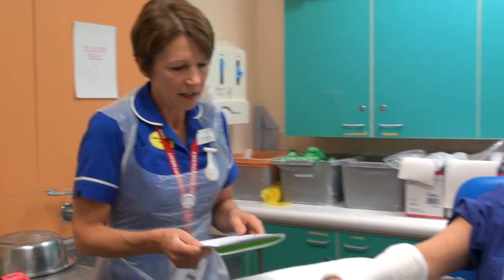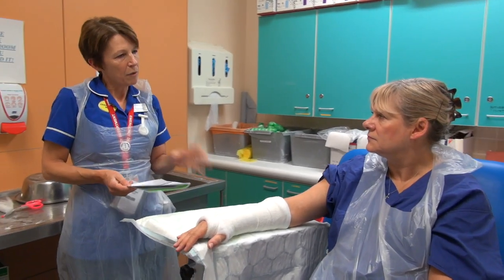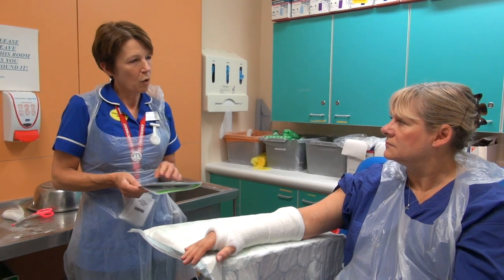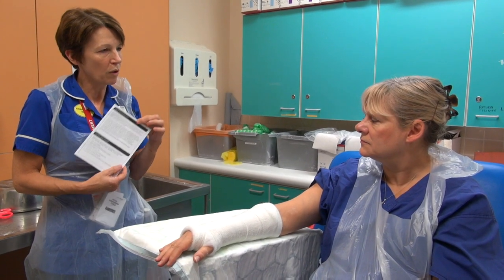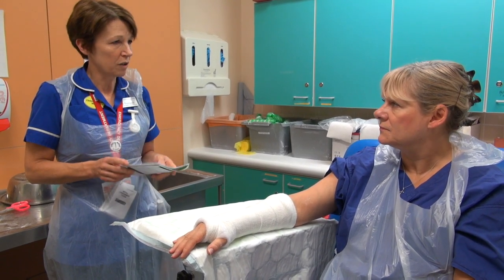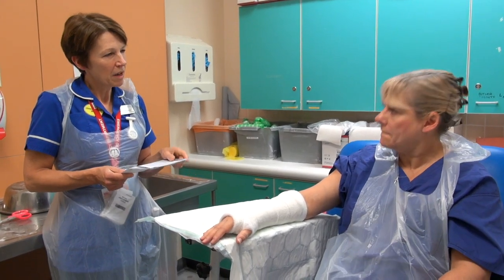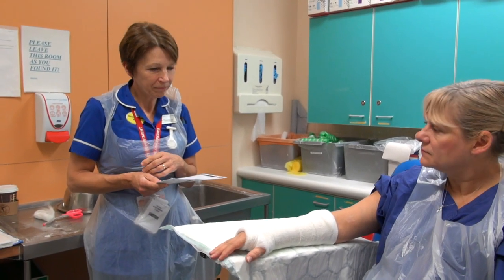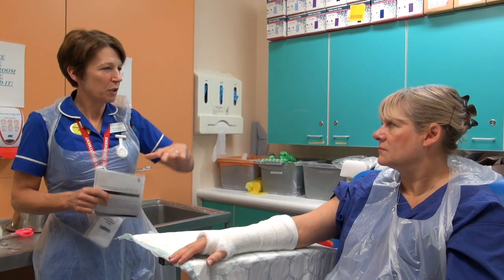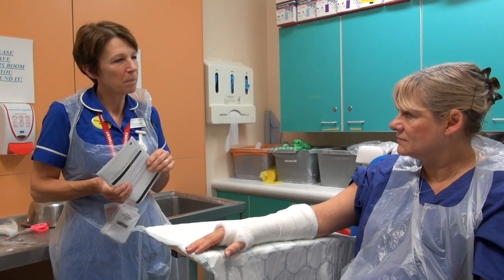Then we just need to give Mag some advice about looking after herself. We need to advise her that if she gets pins and needles, any numbness, blueness in her fingers, if it becomes sore or rubs at all, or any excess swelling or pain, she needs to contact us — there are phone numbers in this book. We're open in the daytime until 8 o'clock in the evening, and then overnight you need to contact the emergency department. Mag will need to allow the plaster to dry naturally — no hair dryers, no sticking in front of fires. We'll put her in a sling, which needs to be kept on for a few days. When in bed at night, rest the arm on a pillow and she can take the sling off for more comfort.